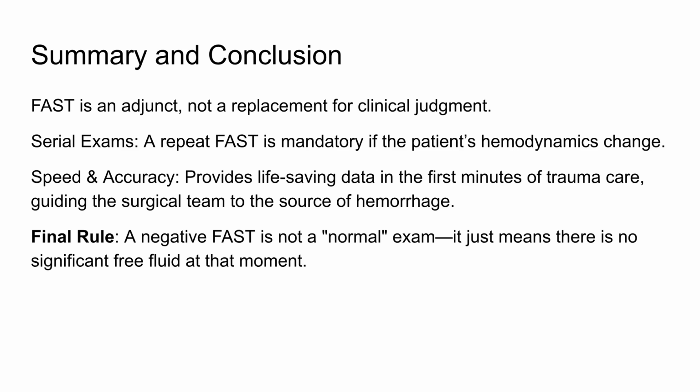In summary, FAST is an adjunct to clinical judgment. Serial exams are mandatory if the patient's hemodynamics change. It provides life-saving data, but remember, a negative FAST is not a normal exam. It just means no significant free fluid at that moment.